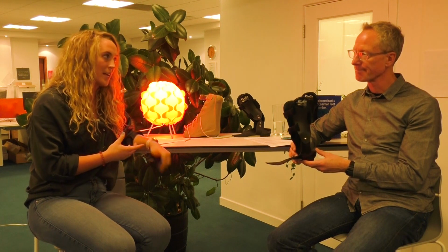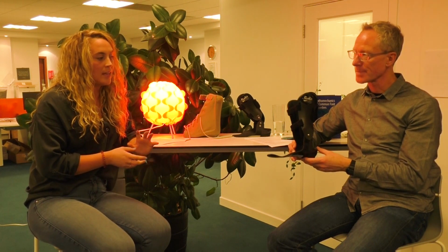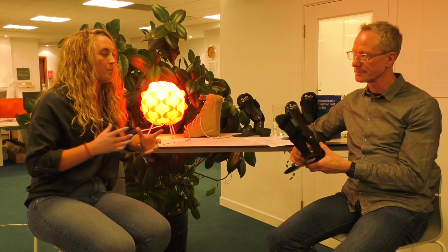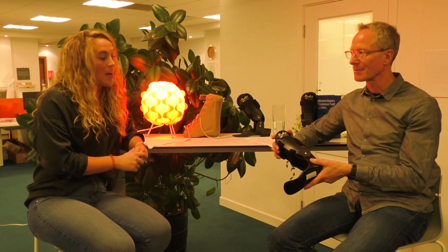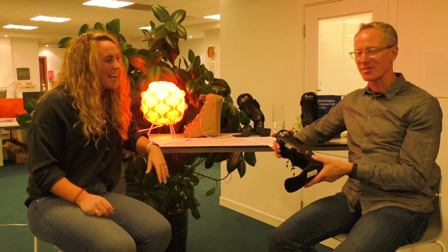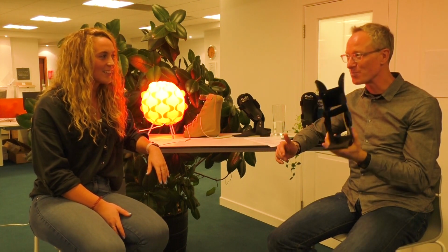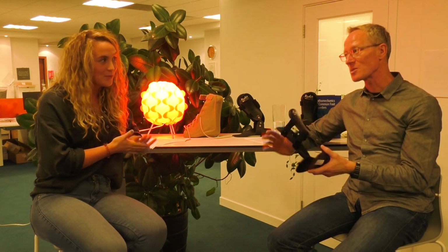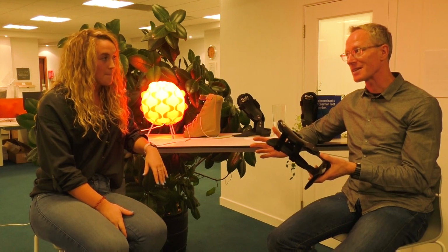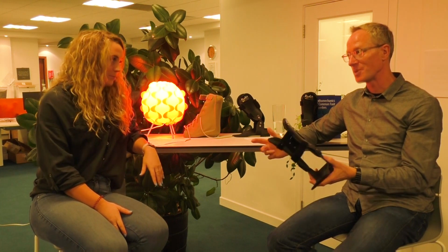Well, again, I think I've mentioned it earlier, but when the gastrosoleus complex is tight, we do see in a pes planovalgus foot type that the midfoot compensates a lot of the time, and so what we'll see is that as that gastro gets tighter, it bullies that foot, and that's the term I would use. That's a great word. I love that. Sarah, remember she said that the gastrosoleus bullies the foot. Not all feet, but especially that highly compliant foot. Well, especially if you've got a lack of ligamentous integrity there. Exactly, and strength in the tib post tendon.